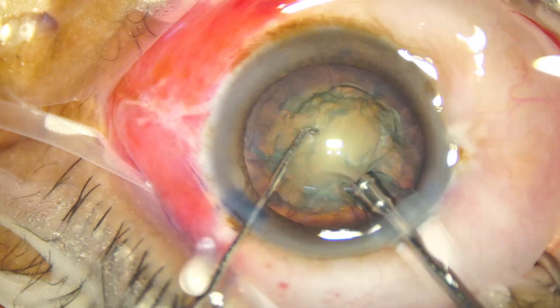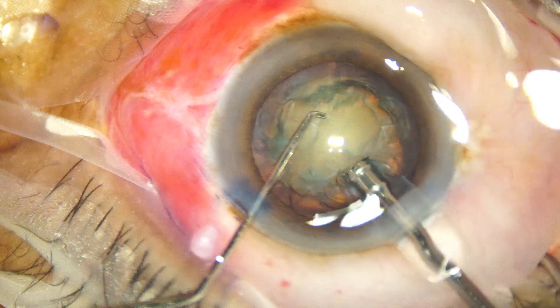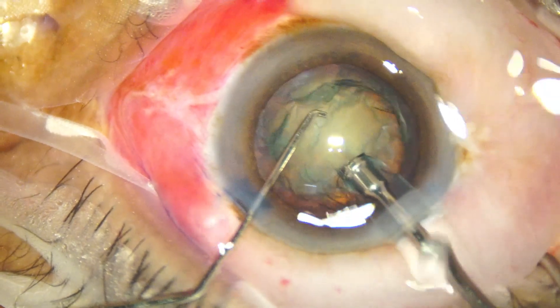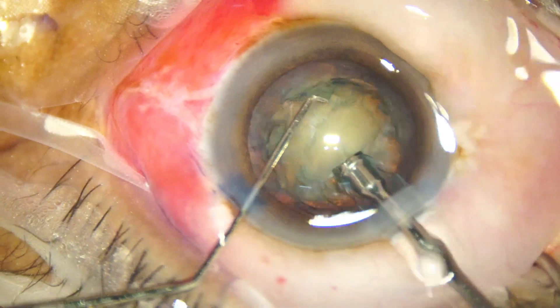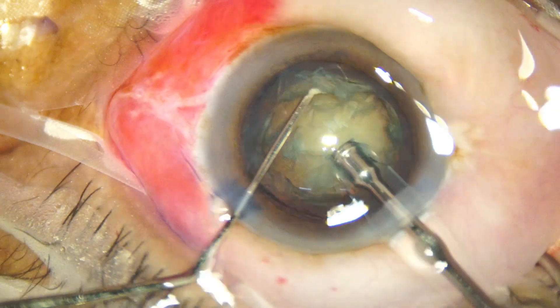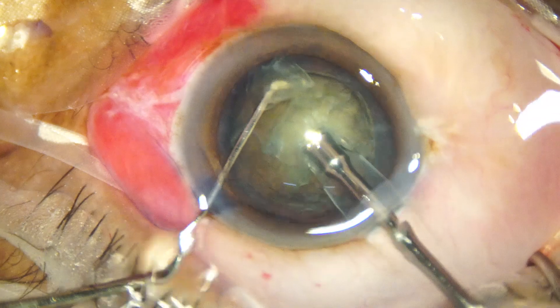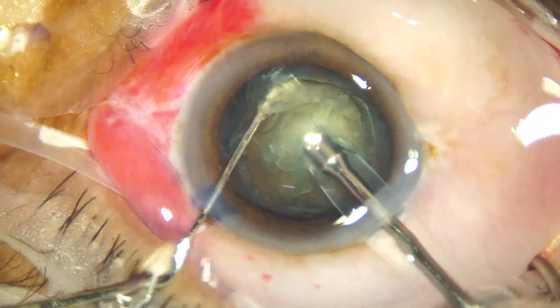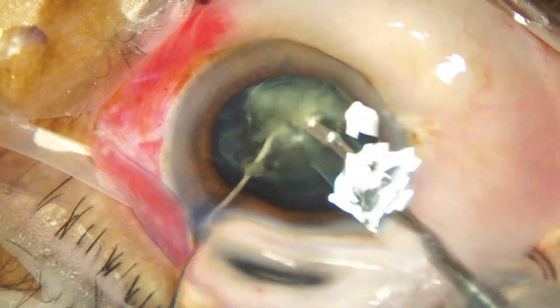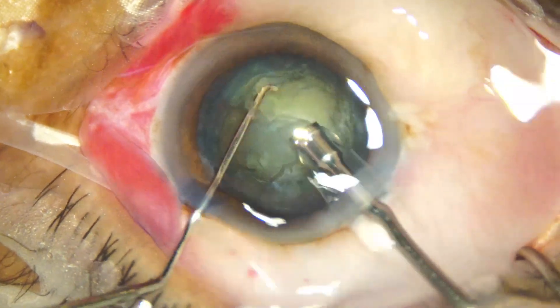The exposed part of the tip is a little less — I think it should have been a bit more. Then you can bury the tip nicely in the substance of the nucleus and get a nice hold. Here she tries to hold it; she has a very good purchase, but the chopper was not vertically down and it scratched the anterior surface.